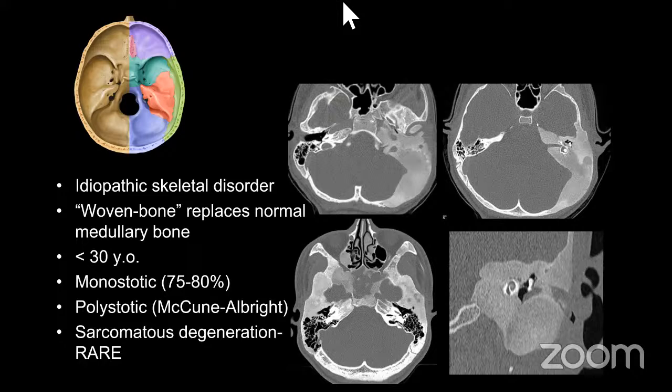Here's this diffuse aggressive skull base mass. And what is this? Is this an aggressive tumor? Is it a bad infection? So on and so forth. And it's kind of a joke. If you ask a radiologist, sometimes I've heard the jokes all the time. Well, the radiologist just wants you to order another study. But just realize, especially when it gets into the skull base, CT and MR are complementary.